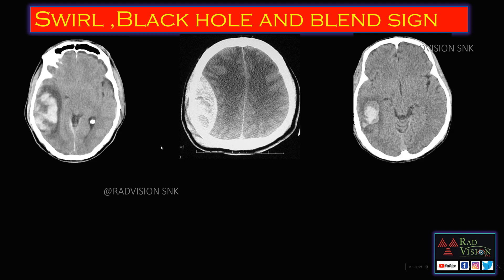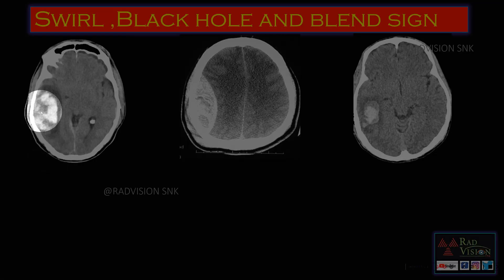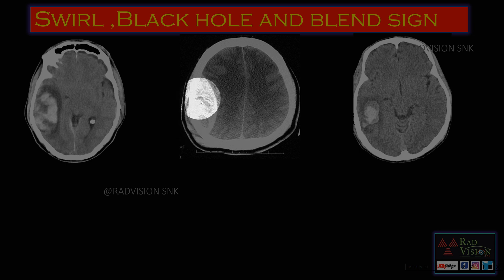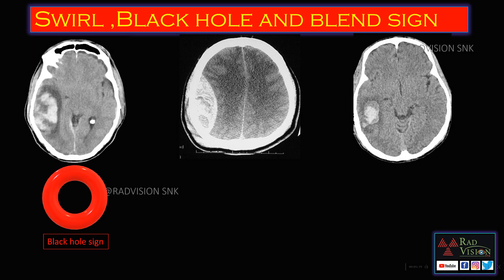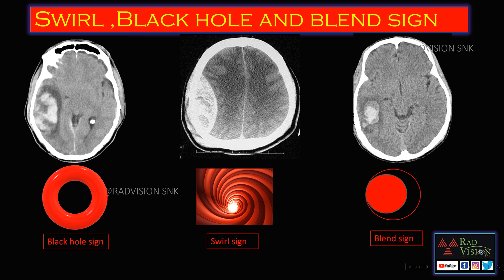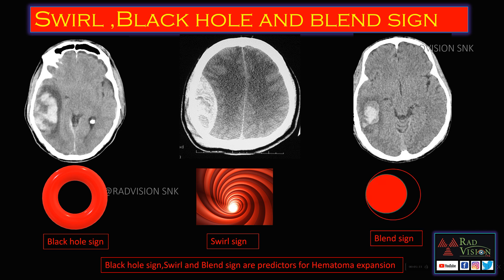Next we will see the swirl sign, black hole sign, and blend sign — three in a row. Here is the black hole sign; here is the swirl sign with alternating hypodense and hyperdense areas; and here you can see the blend sign where two different densities blend with each other. These three signs — swirl sign, black hole sign, and blend sign — are indicators for hematoma expansion. Whenever you see these signs, take a follow-up scan and assess for hematoma expansion.